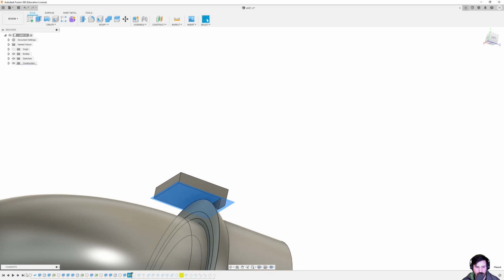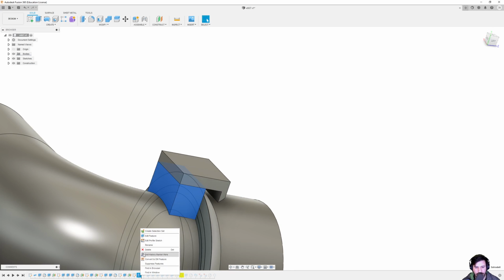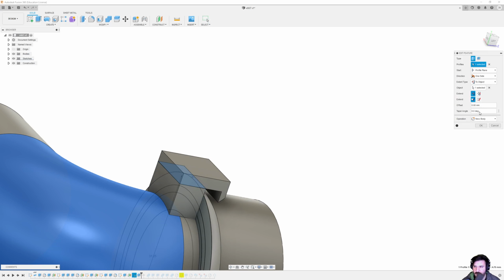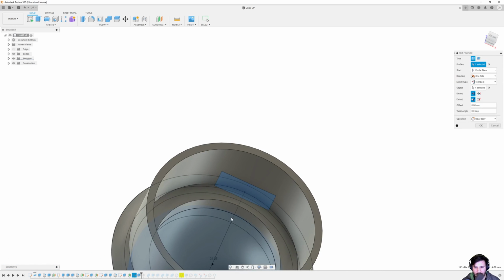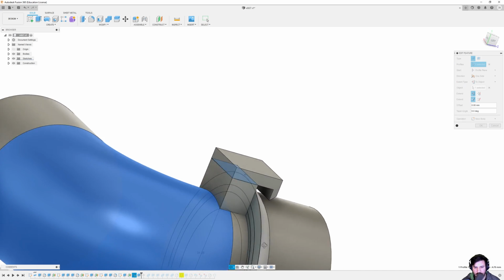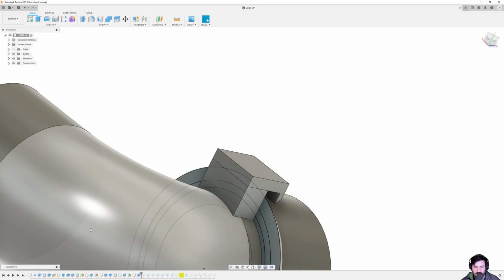That's selected. And I pulled that, let's see, I pulled that down to the actual device. If I go into edit feature, you can see the "to object" means it'll start there and it'll go until it hits an object. And that allowed me to have that exact curve on there instead of previously it intersected and went inside. And if I didn't do it right, it would pop through the bottom and you would have all sorts of errors saying, oh, it's intersecting with itself and all that. So that helped out a lot.